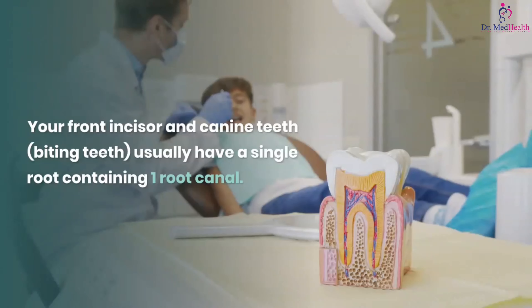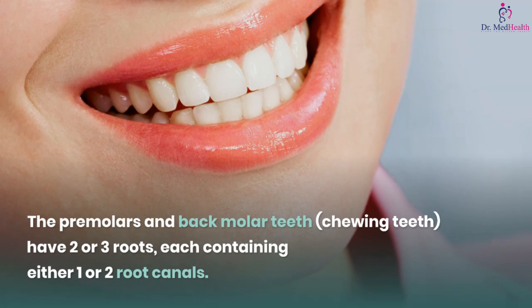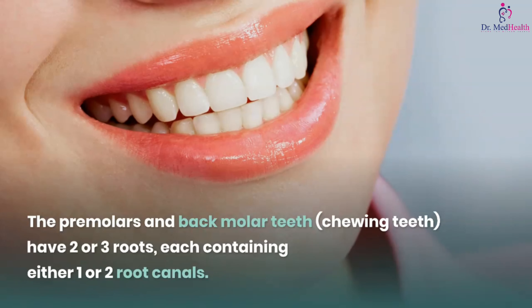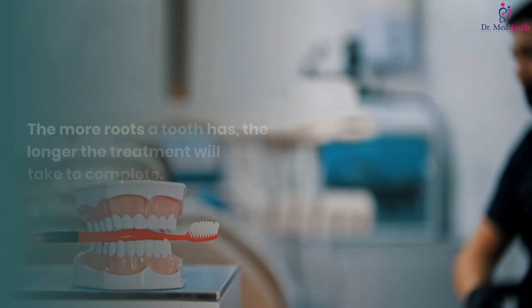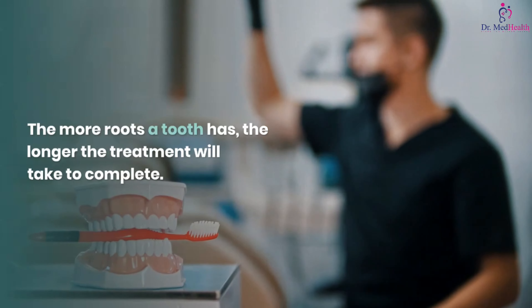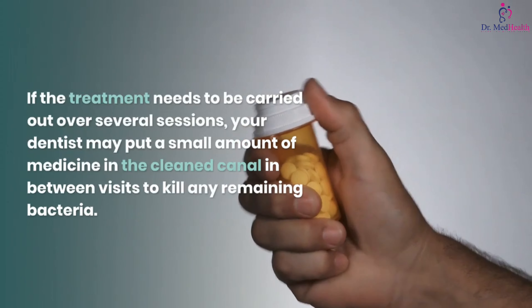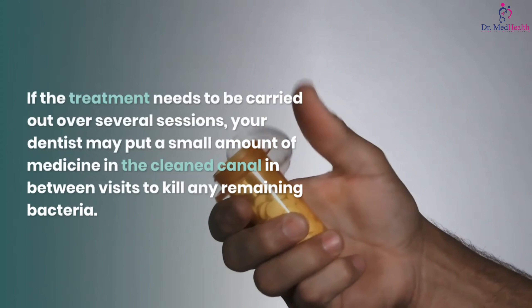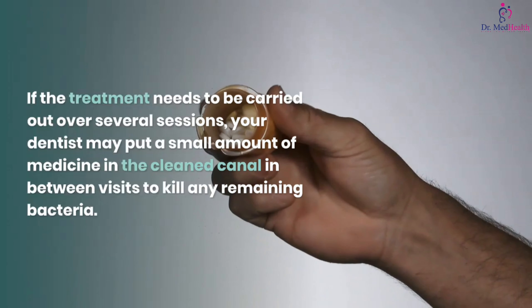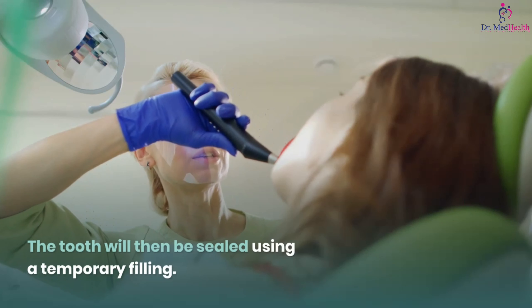Your front incisor and canine teeth, the biting teeth, usually have a single root containing one root canal. The premolars and back molar teeth, the chewing teeth, have two or three roots, each containing either one or two root canals. The more roots a tooth has, the longer the treatment will take to complete. If the treatment needs to be carried out over several sessions, your dentist may put a small amount of medicine in the cleaned canal in between visits to kill any remaining bacteria.